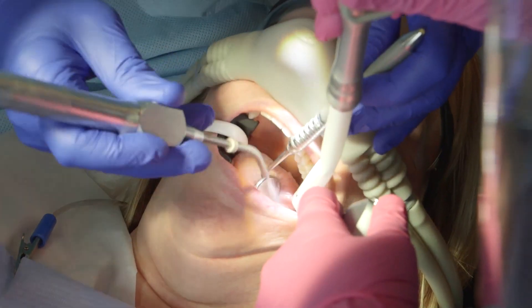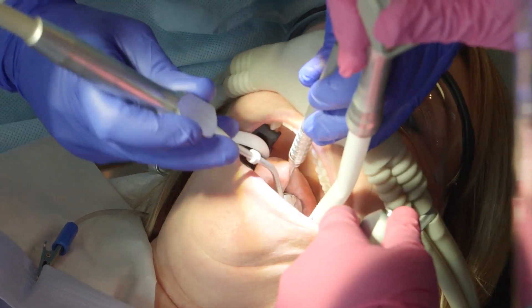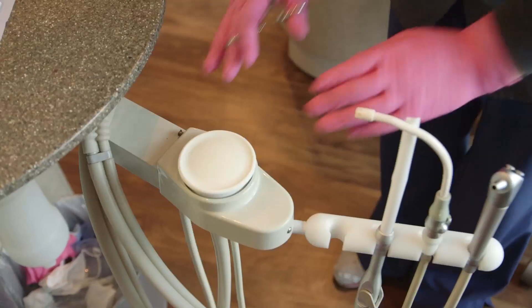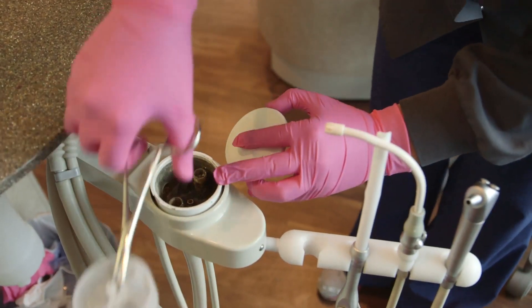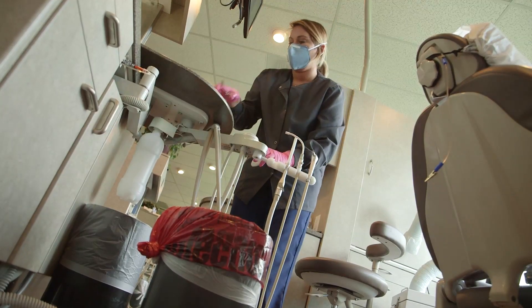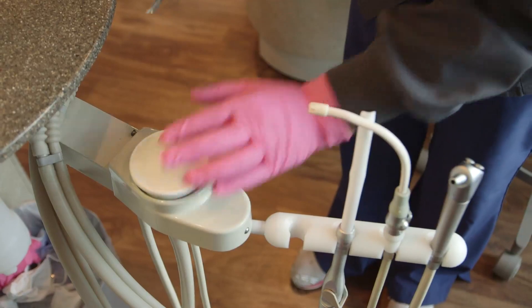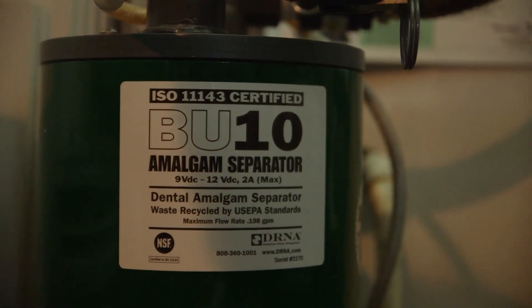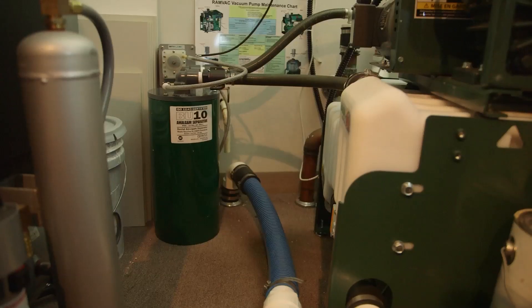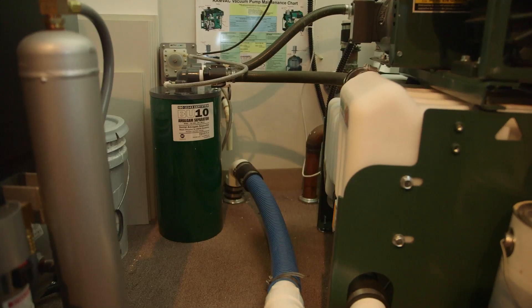Once the removal process is complete, the patient's mouth should be thoroughly flushed with water and then rinsed out with a slurry of charcoal, chlorella, or similar absorbent. During the opening and maintenance of suction traps in operatories or on the main suction unit, dental staff should utilize the appropriate personal protection equipment described earlier. An amalgam separator should be properly installed, utilized, and maintained to collect mercury amalgam waste so that it is not released into the effluent from the dental office.